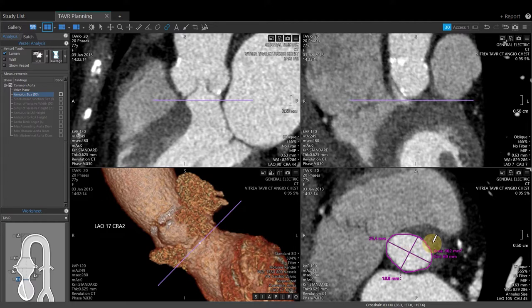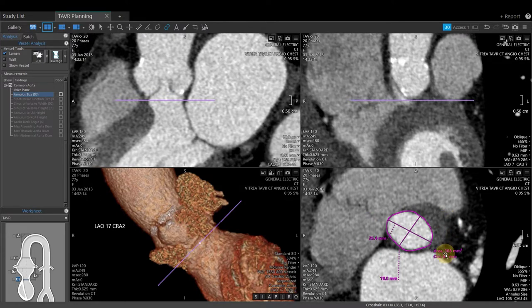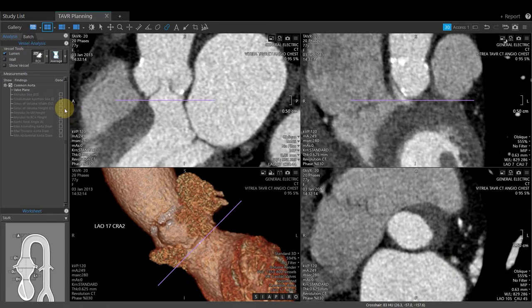Double left-click in the middle and the software will automatically contour the annulus, providing the area, circumference, max and min. To edit this measurement, hover your mouse, add the contour, left-click and redraw when needed. You can smooth the measurement by right-clicking and selecting smooth. If the data quality is not great, do not use automatic or semi-automatic contouring. Delete the measurement by right-clicking and selecting 'delete all' to recreate it using the single click method.